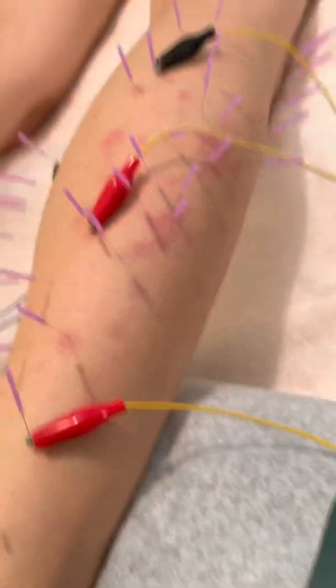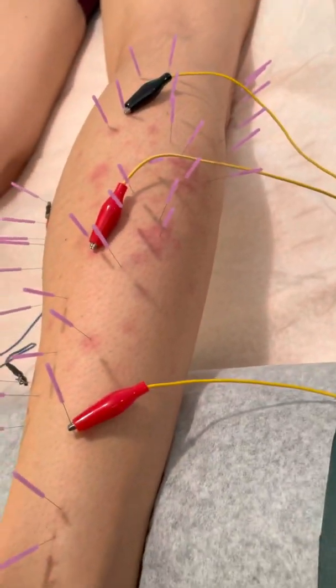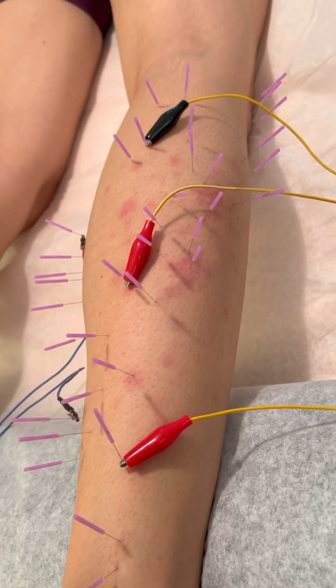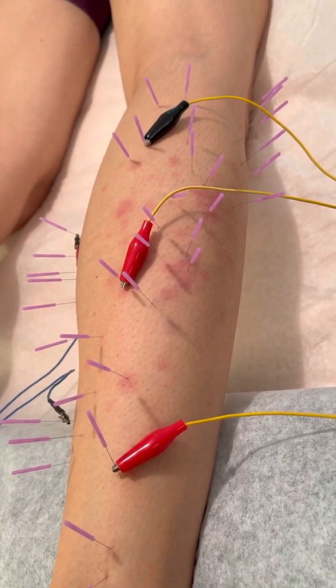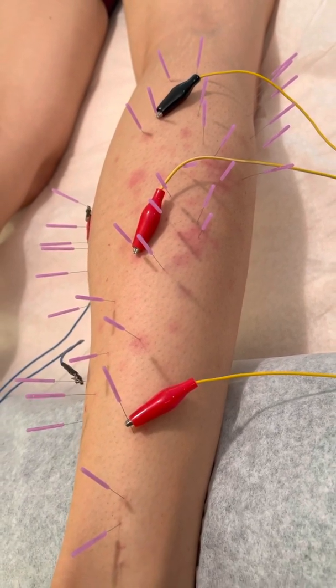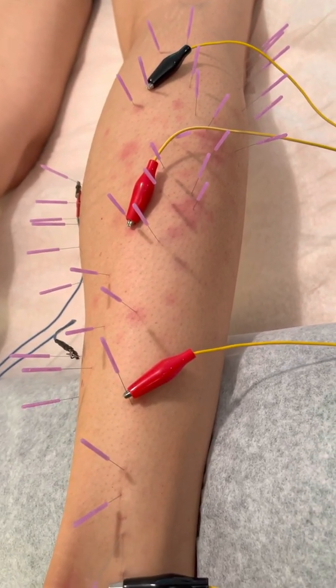Sorry, I'm moving my chair. She has myofascial pain in her lower leg, on this right leg, and by myofascial pain, what that means is activated trigger points with locked short muscles and fascia.